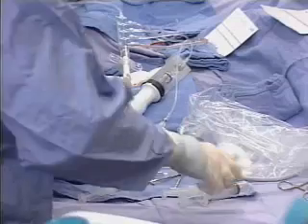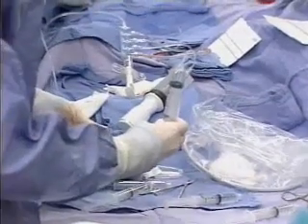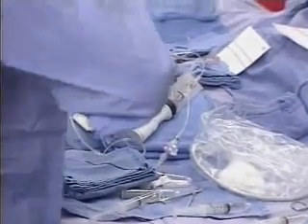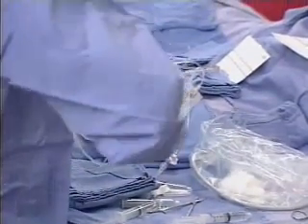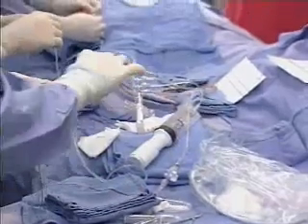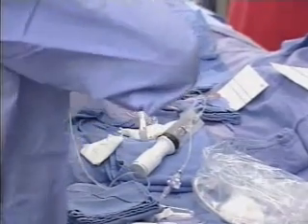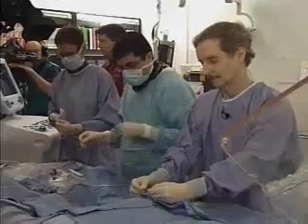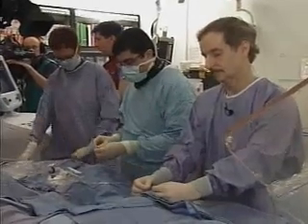In terms of recovery time, one of the other questions was how long does it take to recover? The answer is after the stent is put in, this fellow will go home tomorrow morning and he could be walking his dog on Lake Michigan or riding a bicycle probably tomorrow afternoon or the day after. So the recovery from this is basically almost outpatient surgery. You go home the next morning, typically. So I'm going to just try to get through a couple of the questions there. Bill, you ready to show us the stent?